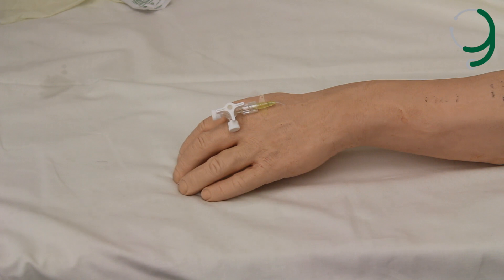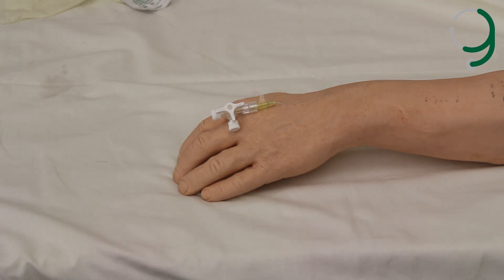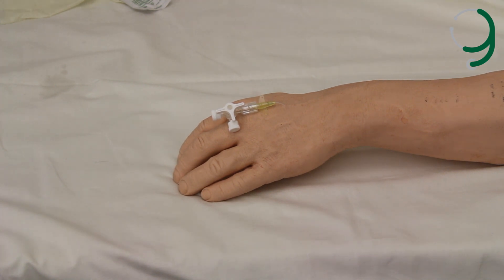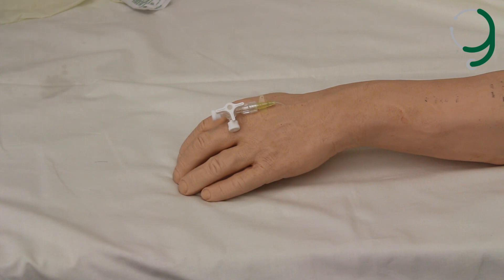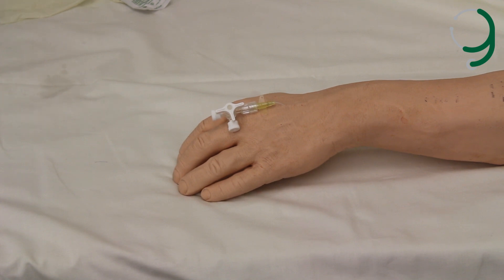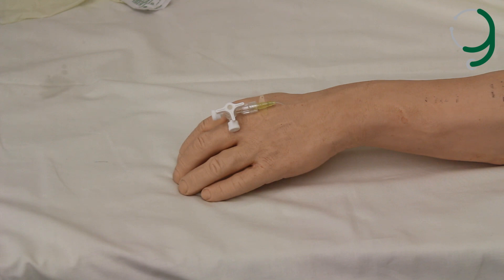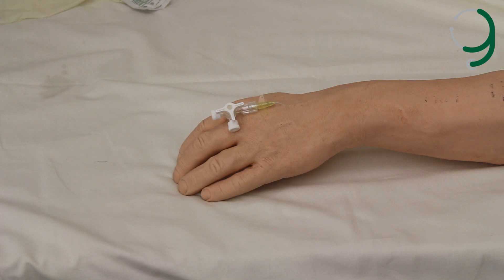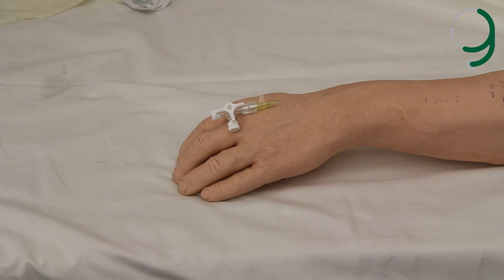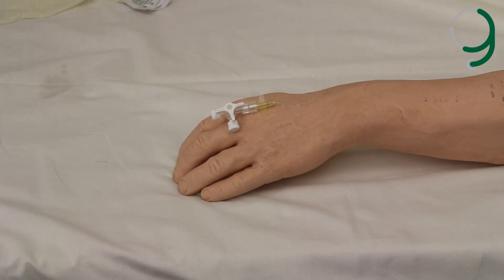Now we move on to the second part of the video, which is IV injection. You check that you're dealing with the correct patient by asking them. You check that you're dealing with the correct drug by checking its name, administration route, dose, and expiry date. You check the time and date the drug should be given, and you see if the patient has any allergies.